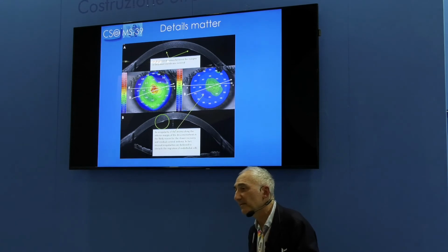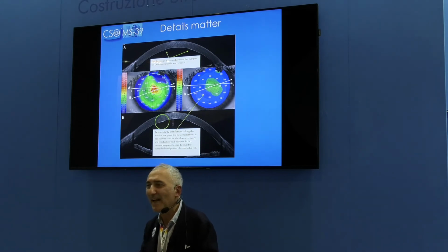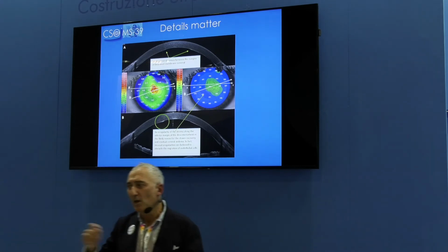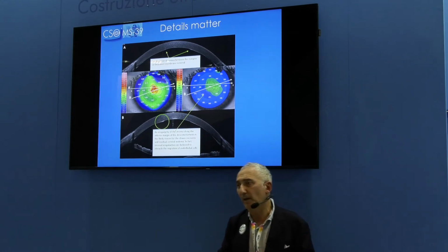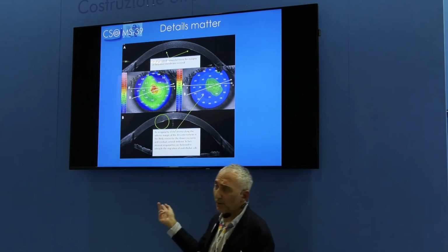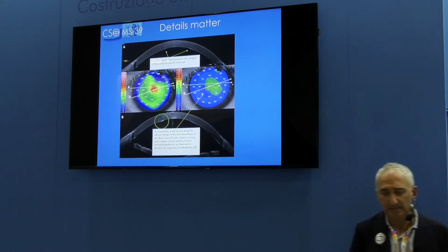What about hexagonality? I don't recall that. I was already happy that we had some cells, transparency, that the patient was already seeing, but we'll keep examining the patient in the future, and I hope that she will recover a little more. But anyway, we decided to do this procedure because the peripheral density was pretty good, was 1,500.